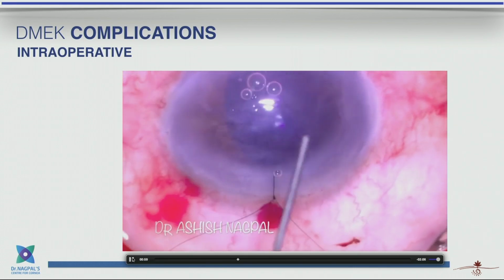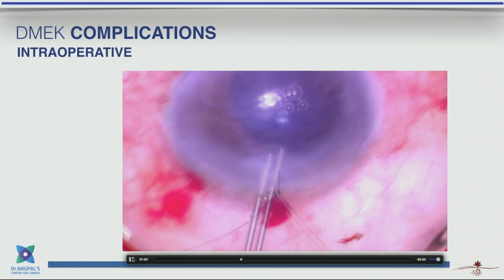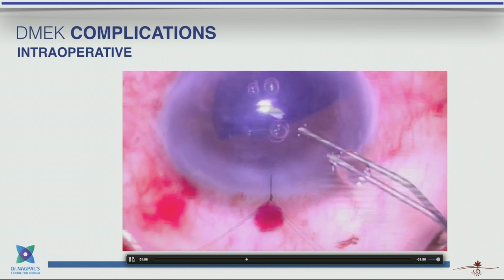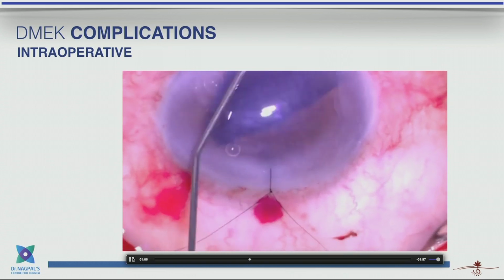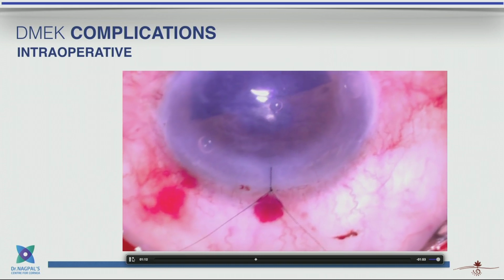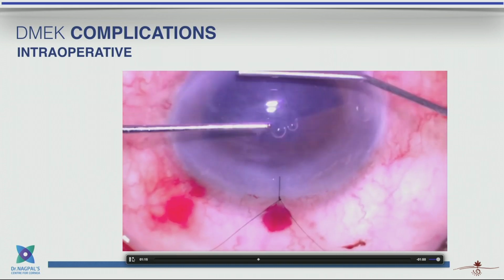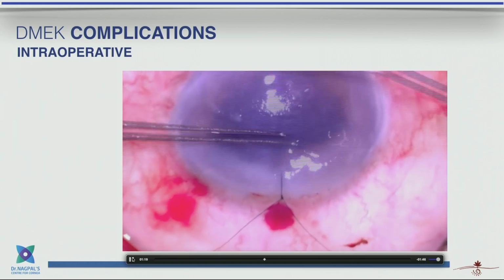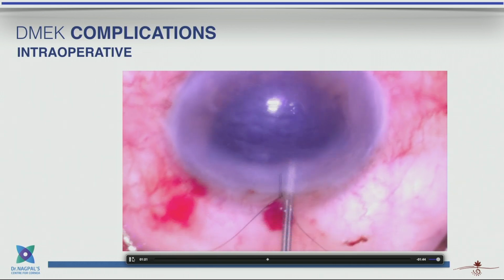So in this case, once it's opened up, you realize after that it's upside down, and then I think it's already been covered very nicely, how you can make Siddharthan's tips and Dr. Liu's tips on how to try and turn it over again, is to push in some fluid, and you can use the double tap maneuver to open it. I think I'll move ahead with this part of the talk.